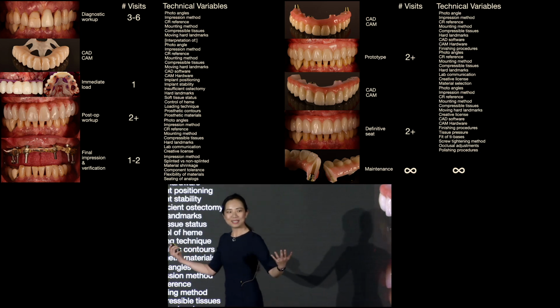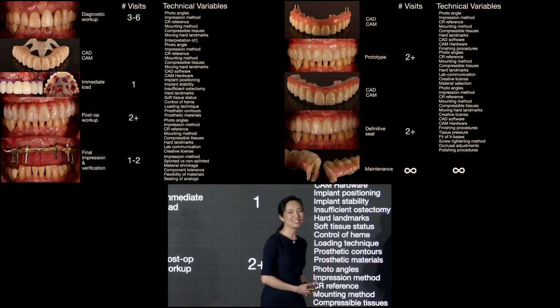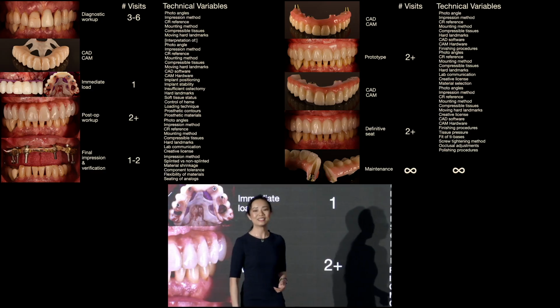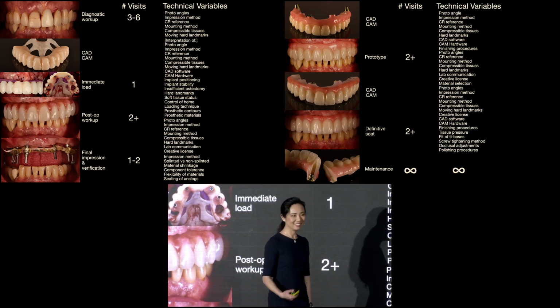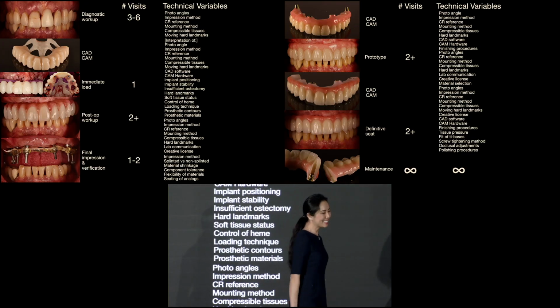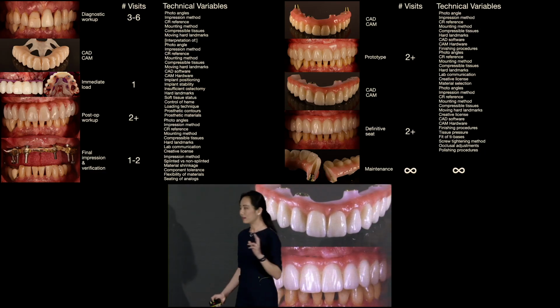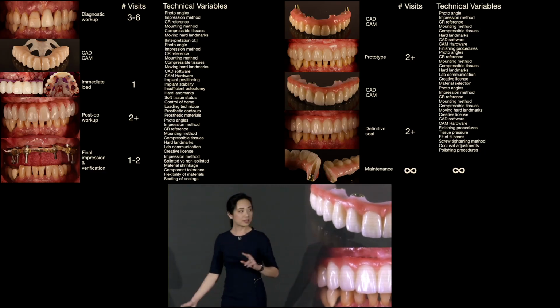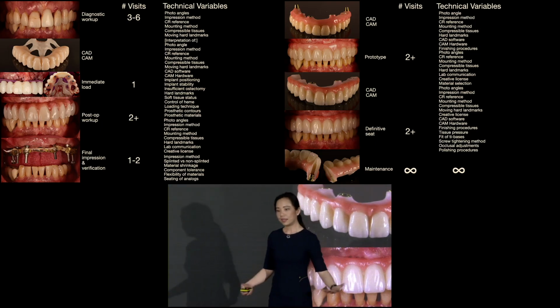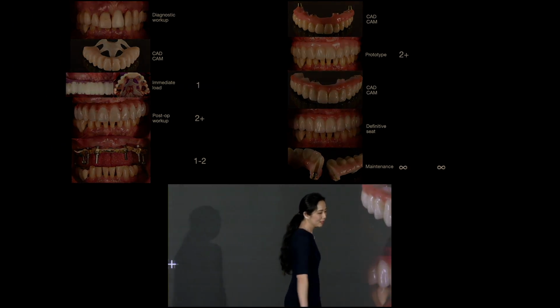How many people in this room has ever had to argue with their lab over their outcome? How many times have you sent denture setup back to move the midline a millimeter? How long does it take the technician to move that midline by a millimeter? Is another great question, and maybe that's why we get the blowback. So just by looking at this huge list of different things where it's either a technical issue on the clinical side or how we even take our photographs, suddenly our communication clearly cannot be that straightforward.